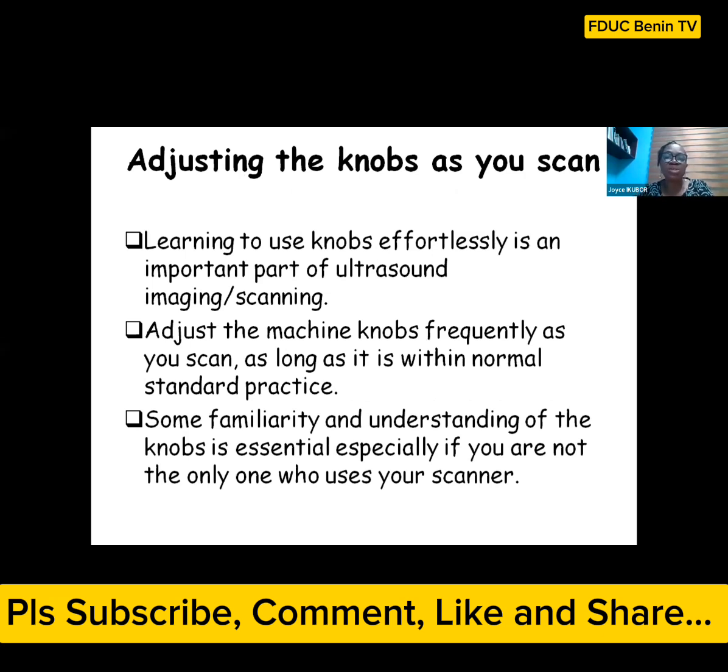This is one of the things you will learn as you improve in your scanning: one hand is on the probe scanning, while the other hand is effortlessly touching the knobs and applying them without even looking. At the initial time when you start, of course, you'll be looking at them, but after a while, you'll find out that you can actually use all these knobs effortlessly to get your optimal image.